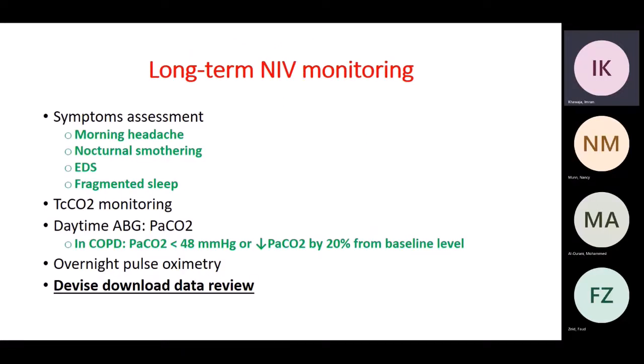Yes. All right, so hopefully we have a few more minutes. What we need to do when we see these patients, please, guys: if you have someone coming to the clinic because of COPD and you say that they are on Trilogy, you have to ask the nurse to get us the report. It's not like one prescription was given to them and then we forget about it. It doesn't have to be that you get the report only when they have sleep apnea.